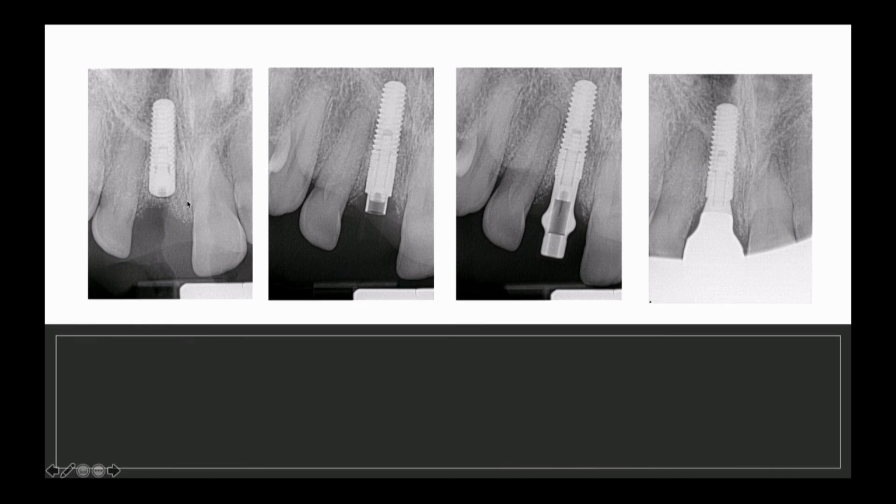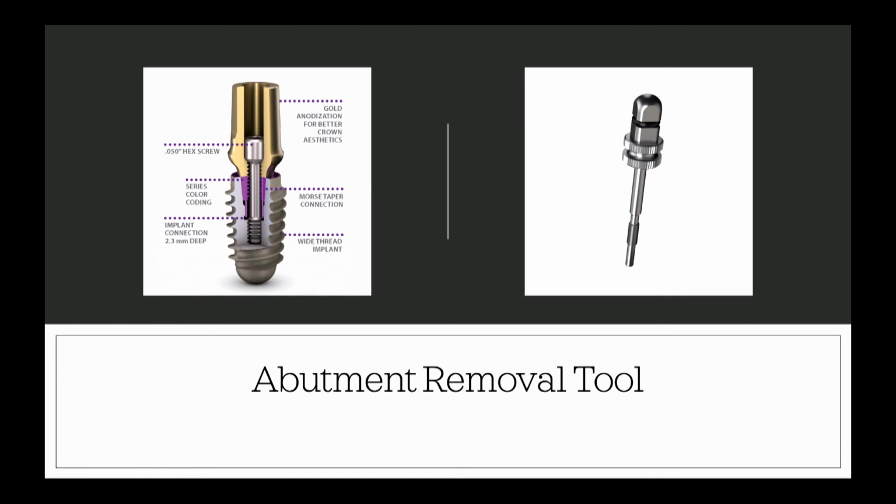All right, so there would be, again, your scan body. This is placed quite a bit subcrestal, as you can see. In this case, we put on the digital scan body, and the digital scan body was actually at the tissue level, so there wasn't much to scan. So you have a way out. You can always go back to your standard impression post, take a standard impression in a situation like this where you've got the implant pretty deep, and then restore the case. So those are just some of the things that you could potentially run into doing your cases.